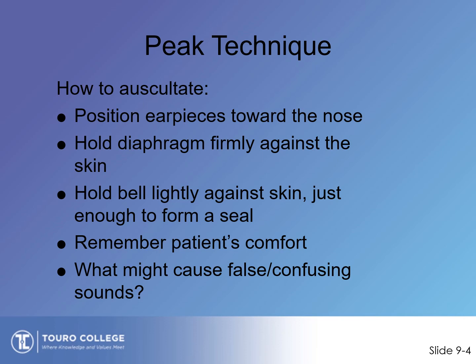Necklaces in the way can cause confusing sounds. Of course, as I said before, friction from body hair, also telephones, and anything that's making a noise around you. Jewelry is a big one. Like if they have a necklace on, I might hear something that really is insignificant.